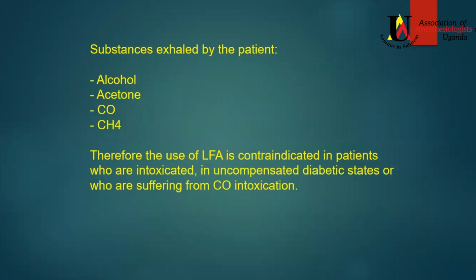Now, what are some of the substances exhaled by the patient? If this person is intoxicated and has been drinking alcohol, they're going to be breathing out alcohol. Acetone for our diabetics, carbon monoxide, and methane. So this automatically contraindicates this technique in patients who are intoxicated, patients with uncompensated diabetic states, or those suffering from carbon monoxide intoxication, because you will just be recycling all these into the patient and they could have a lot of effects.